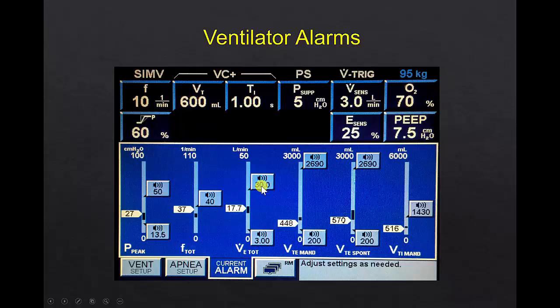The first time it happens, it might be a light comes on. The next time, the light stays on. The third time, an alarm goes off. And the fourth time, if it prolongs the ventilator alarm state, there might be a continuous, loud, noxious alarm that will catch anyone's attention. A couple of other things about ventilator alarms is they are a very nice way to detect a vent disconnect. For example, if you look at the peak pressure is at 50, that's to make sure that the ventilator doesn't push too hard.